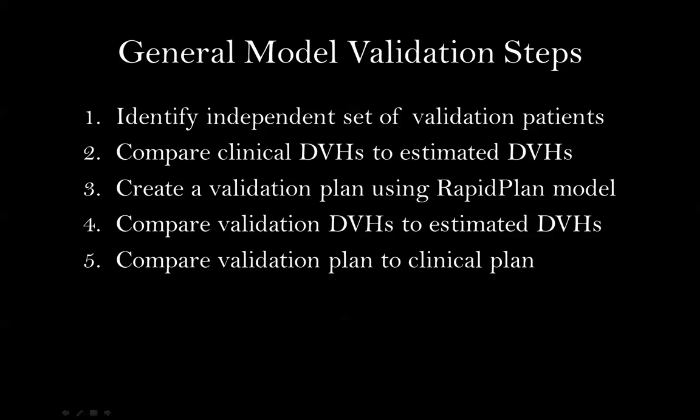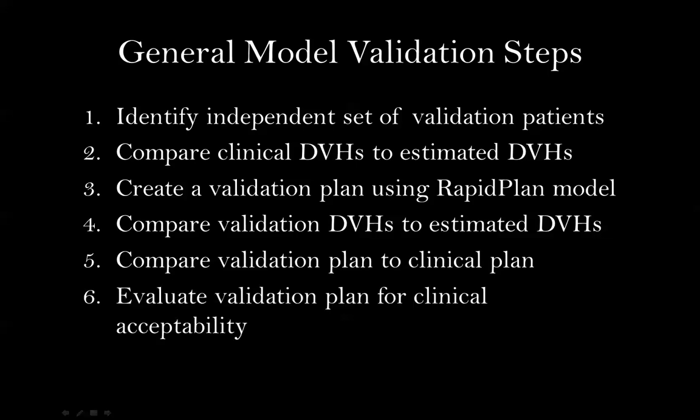5. Compare the validation plan to the clinical plan. And 6. Evaluate the dose distribution and DVHs of the validation plan for clinical acceptability. Let's discuss these steps in more detail.